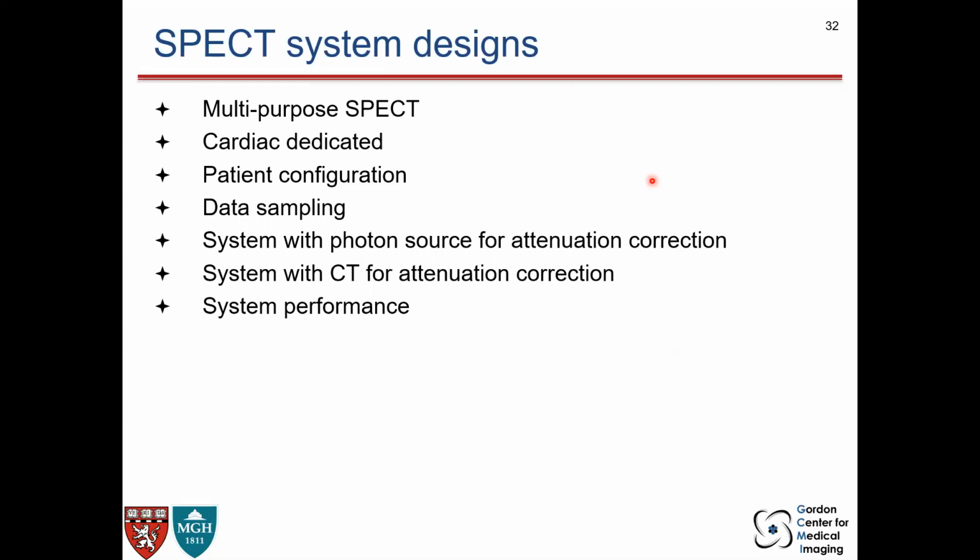So you can apply them for cardiac imaging, you can use the protocol for bone imaging and brain imaging. Again, conventional dual-head gamma cameras are not excellent systems in terms of performance, but they are easy, flexible, relatively cheap compared to very high-end systems, and can be repurposed for different applications.